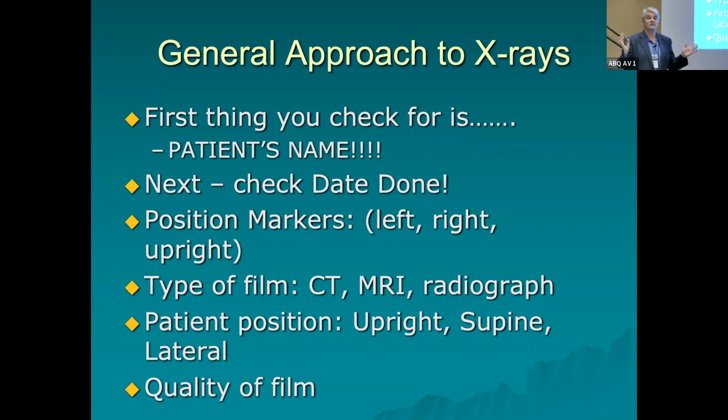That's the easiest way to miss a malpractice suit, is to make sure you're interpreting the right patient, okay? So always check to make sure the patient's name is correct. Also look at the date it was done. Well, duh, Greg, I know what date it's done. It's the day that I ordered it.